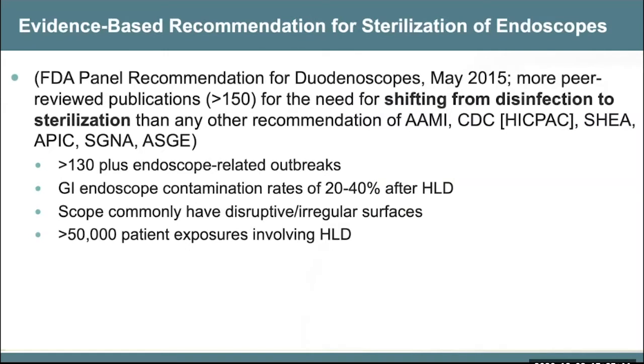So what is the recommendation? Many of us, including Dr. Rutala, myself, and my professional society, the Society for Healthcare Epidemiology of America, all believe that the FDA needs to move to requiring not disinfection, but sterilization, as many other societies have, listed here too. This gives you a much greater margin of safety, and this could be achieved in a number of ways. A steam sterilizable scope.